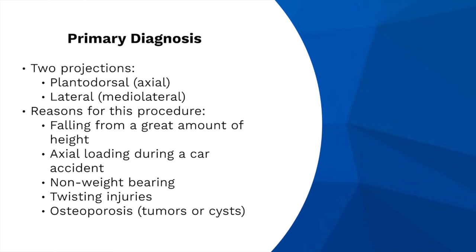To view the calcaneus alongside the talar articulations and the talocalcaneal joint, two projections are performed: the plantar-dorsal axial and the lateral mediolateral projection.